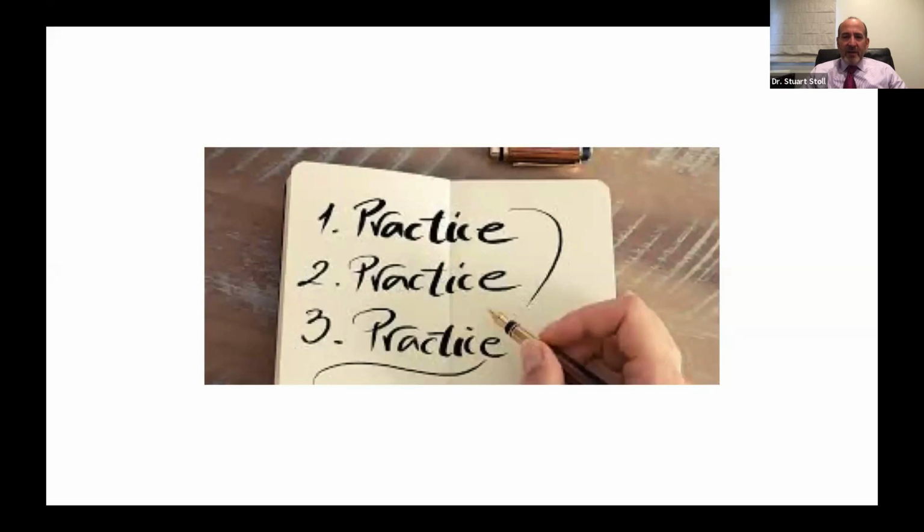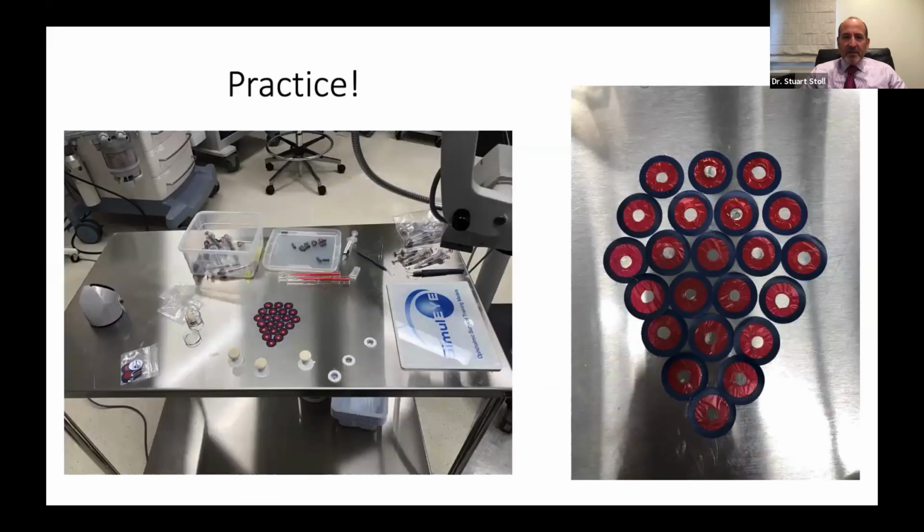The main takeaway here is practice, practice, practice. There's really no excuse in this day and age not to practice. Here's showing the practice that I did just for making these videos. It's a simple setup. I'm in my own OR. Here's my phaco machine. Here's my microscope. I pulled over a side table.